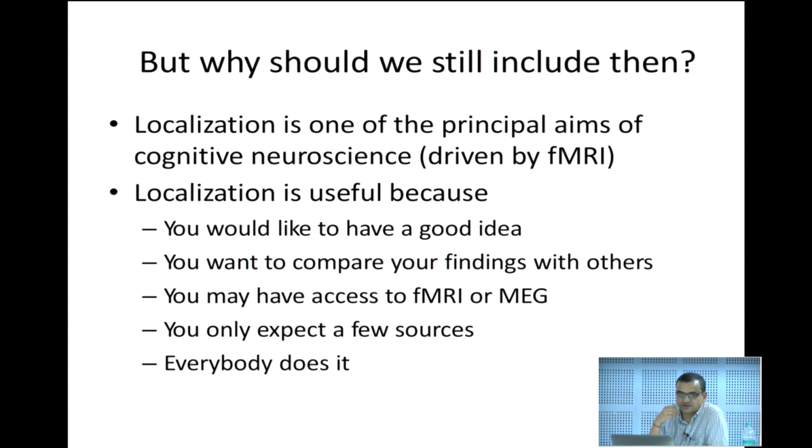Now, when you record an EEG, we talked about its excellent temporal resolution, but if we cannot localize the brain activities, then our interpretation is still less than complete, because we cannot say where in the brain this is happening. And unless we can tell where in the brain it is happening, we can only provide some kind of hand-waving explanation.